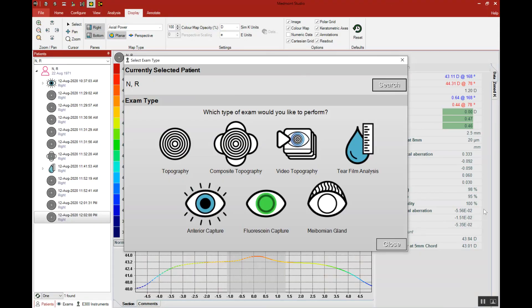So a very simple process of being able to acquire topographies, multiple images on each eye, and we can do both rights and lefts within the same window and within the same session.